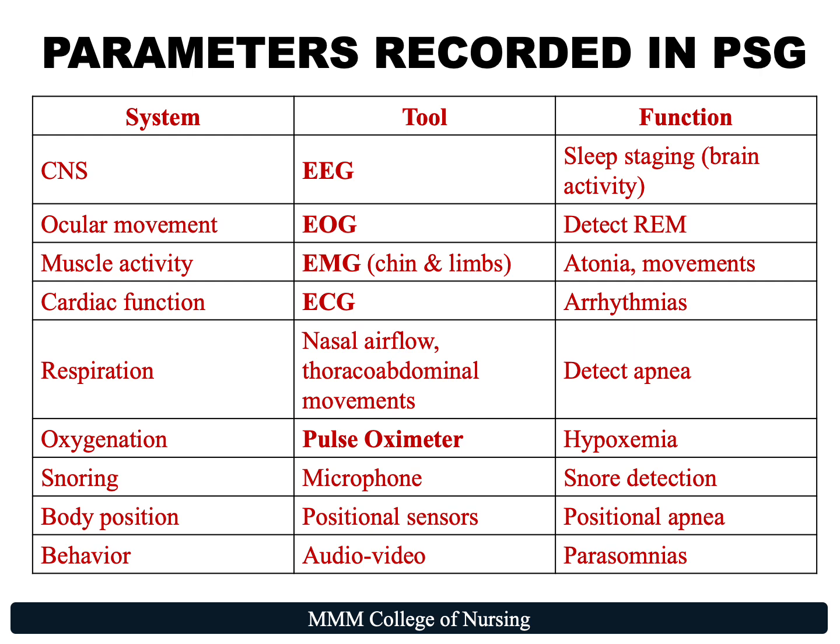through brain activity. The next is to see the ocular movement, and the tool used is electrooculography, which is a technique using electrodes around the eyes to measure the electrical potential difference, otherwise referred to as corneoretinal standing potential between the cornea and the retina. This helps in detecting eye movements, blinks, and assessing retinal health. So in PSG, this is used in detecting rapid eye movement sleep.